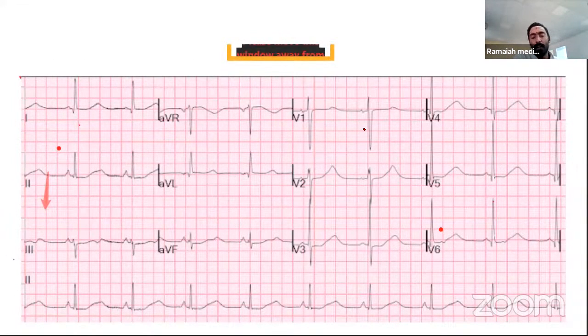Whenever we look at the ECG, it is a graphical representation of the entire electrical activity. So we should know what each component represents. The electrophysiological system has its own implications. But coming to the interpretation, we look at the P wave, which represents atrial depolarization.